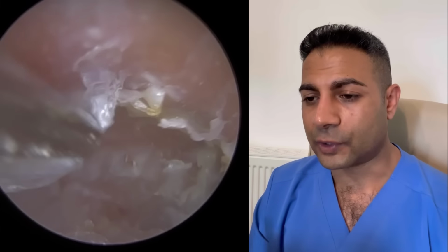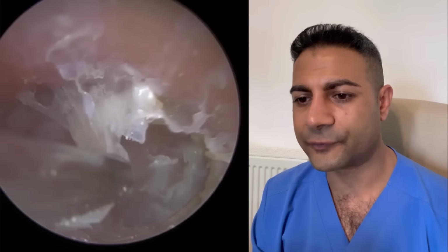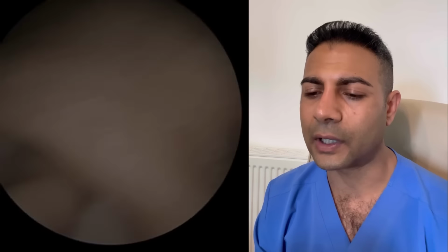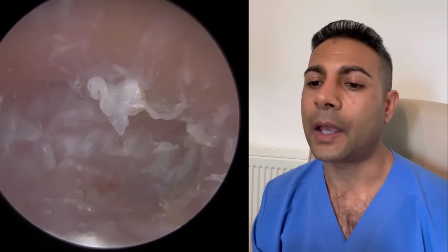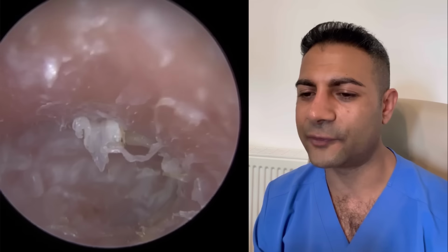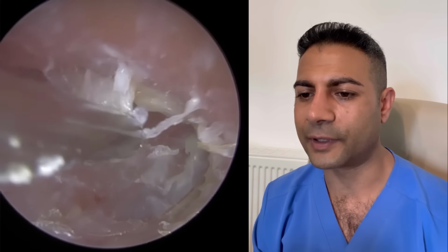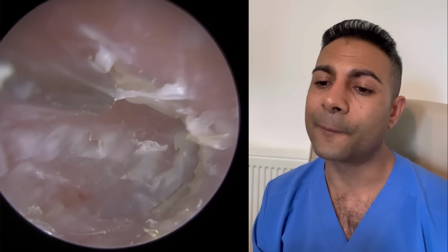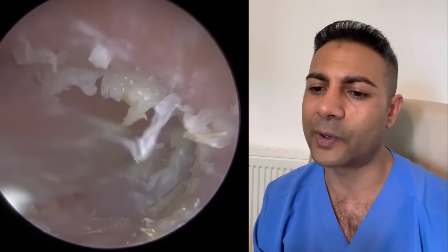I understand a lot of audiologists do, and that's fine, as long as the patient is aware of the risks. In the UK, we've got the National Institute of Clinical Excellence guidelines, and irrigation is regarded as a method of earwax removal. And I understand also some cases, especially if it's really mushy wax on the eardrum, water irrigation would probably be easier to perform to wash that away. But for myself, and that's just a personal preference, I try and stay away from water.